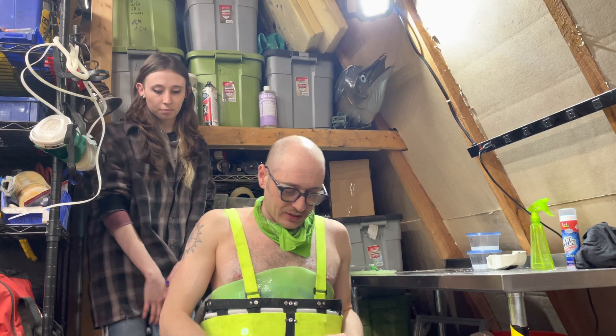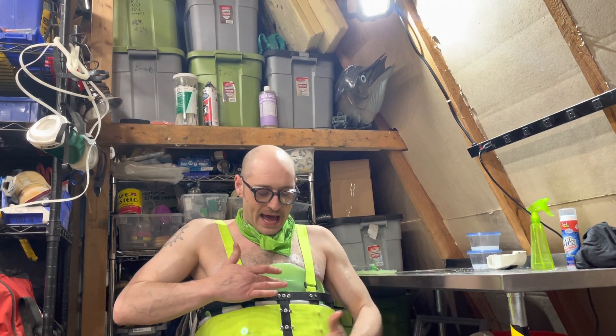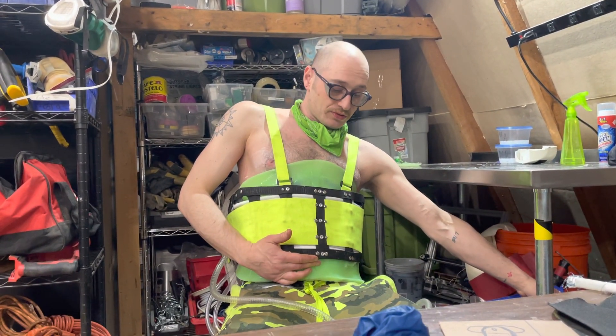This part is the tricky part. You need to be sitting back, turn on the vacuum, and go around and kind of press near the small of the back, the bottom of the sternum, and the belly — and try to get a seal. We're going to try to get a seal.